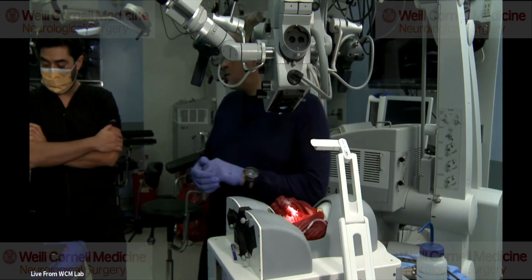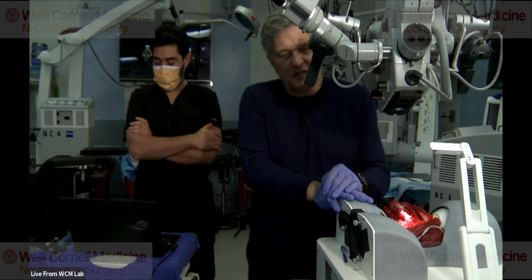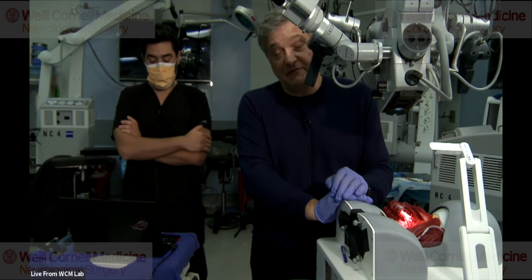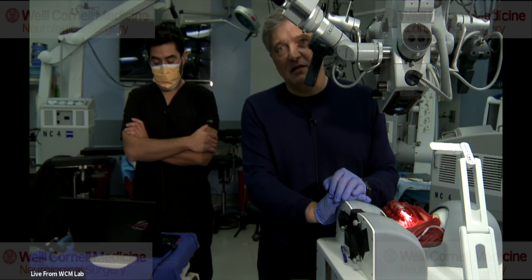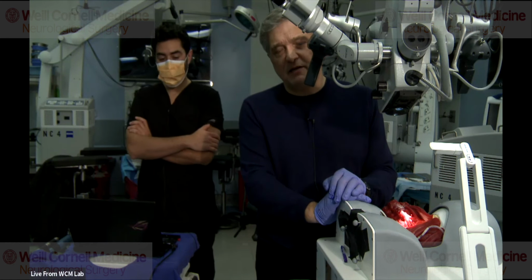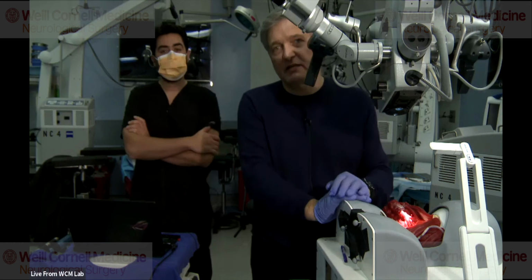Mayfield or Gardner-Wells tongs? I guess Mayfield. The whole point is not to move the patient, so keep it stable. When you use navigation, you're kind of committed to the Mayfield head holder. Gardner-Wells tongs are great, and I've used navigation with them as well, but it's not ideal. The traction is a nice idea, but for me the navigation is more helpful, so I don't use the Gardner-Wells tongs. I used them for a while when I didn't navigate, but I don't use them anymore.